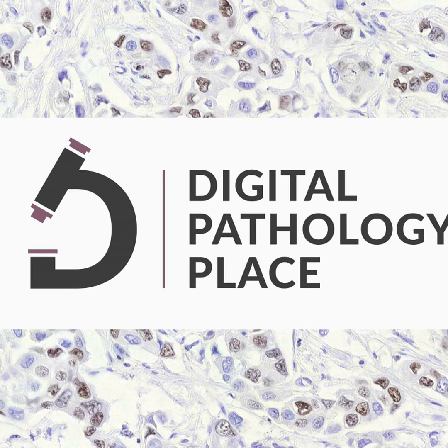Notably, the reach of digital pathology expanded beyond human medicine. In 2014, IDEXX became the first veterinary diagnostic laboratory to embrace digital technology and provide remote veterinary pathology diagnosis. This milestone, achieved by veterinary pathologists, paved the way for human pathologists, and it happened 3 years before the first system for human pathology primary diagnosis was officially approved by the FDA.